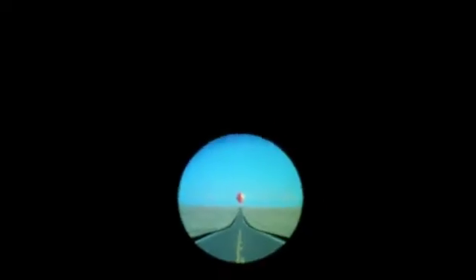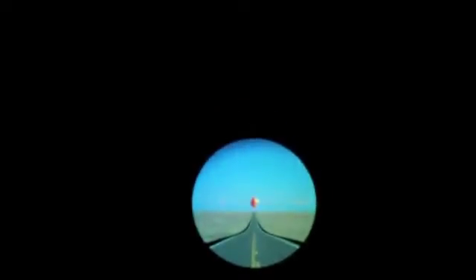I took some footage of what it looks like in that box, and during the test it's going to come into and out of focus, but that's completely normal. There's nothing to be worried about if it gets fuzzy — it has to get fuzzy so the machine can work.